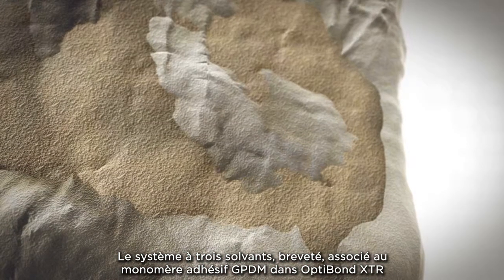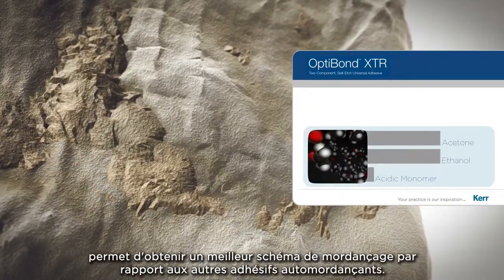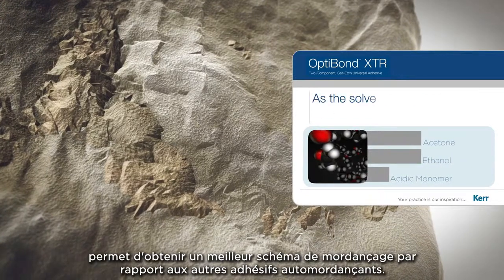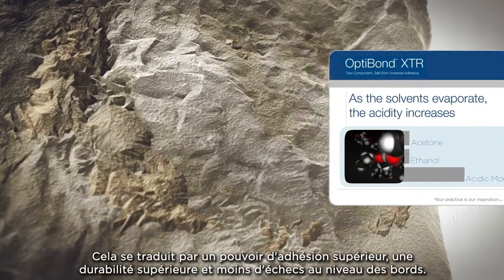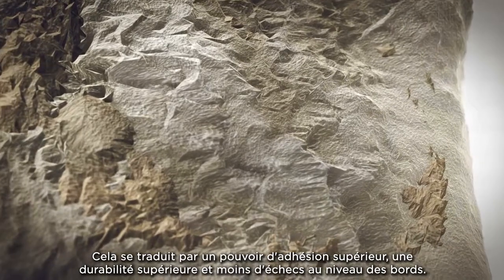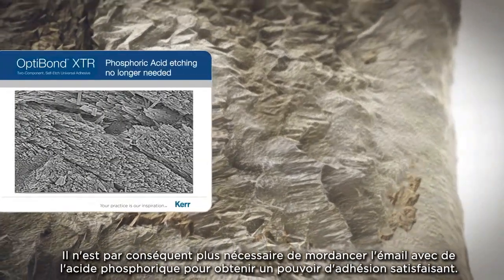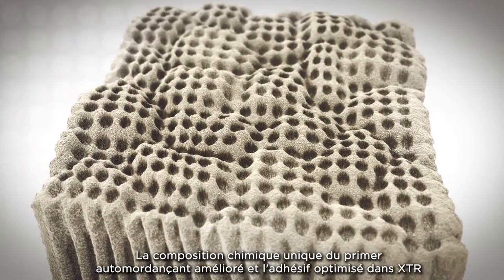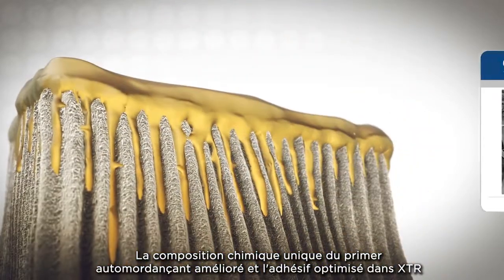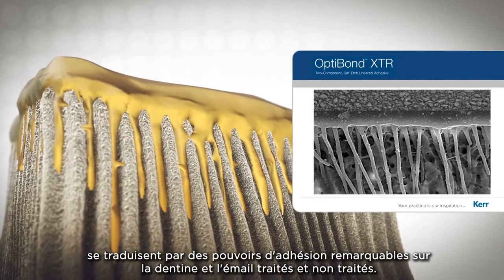The patented 3-solvent system, along with the GPDM Adhesive Monomer in OptiBond XTR, is able to achieve a better etch pattern than other self-etch adhesives for better bond strength, durability, and less marginal failure. Therefore, phosphoric acid etching of the enamel is no longer needed to achieve good bond strength. The unique chemistry of the enhanced self-etch primer and optimized adhesive in XTR brings outstanding bond strengths to cut and uncut enamel and dentin.